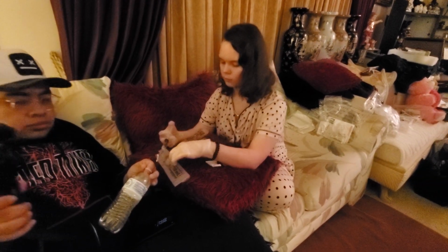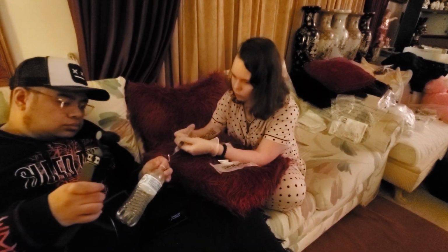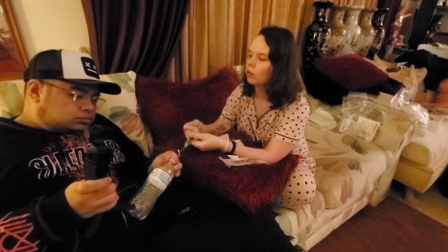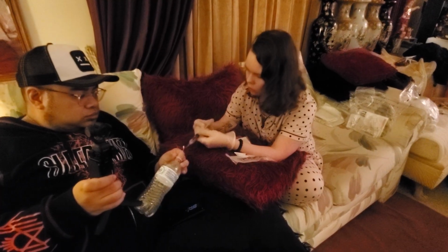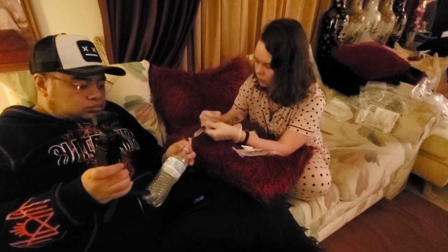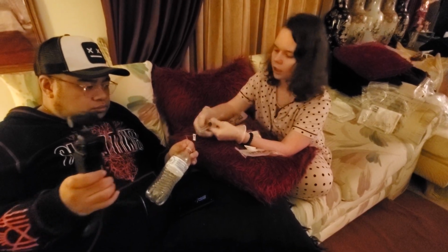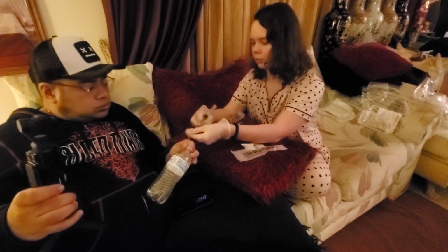Once I have flushed, before I take this off, I now have to waste 10 mLs of blood. So I'm going to pull back on my plunger and make sure I get 10 mLs of blood to waste. Pretend I got 10 mLs of blood and not a bunch of air.